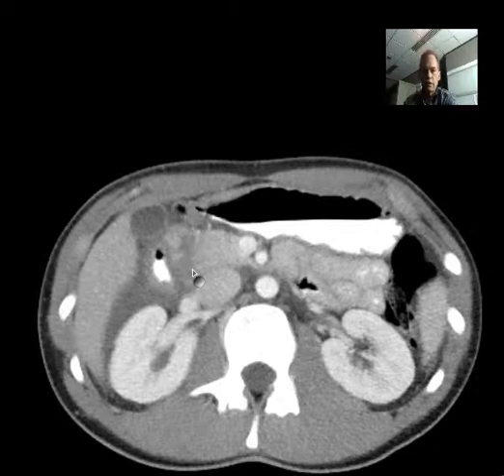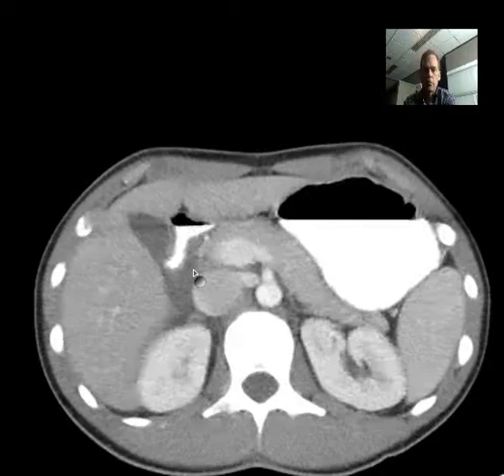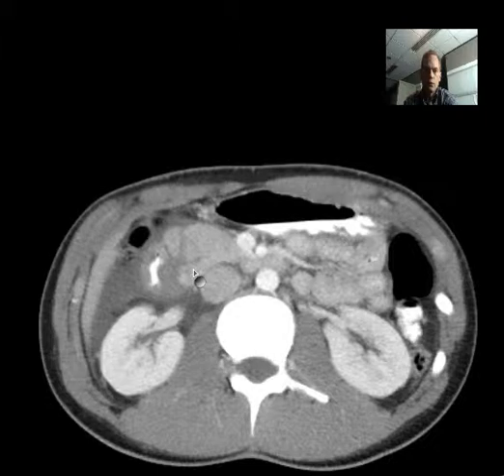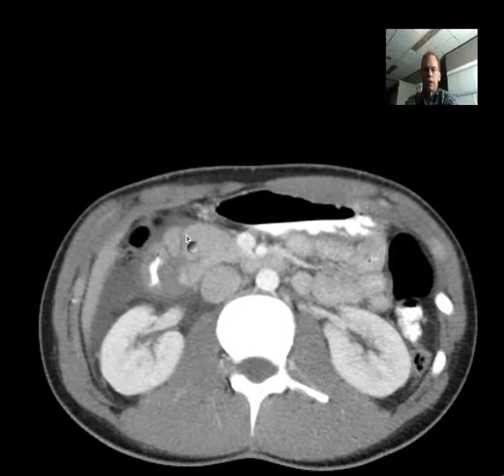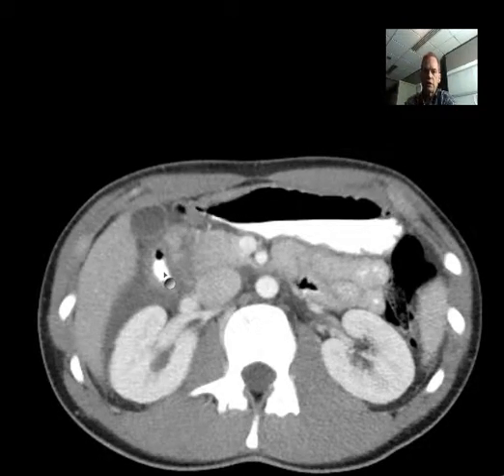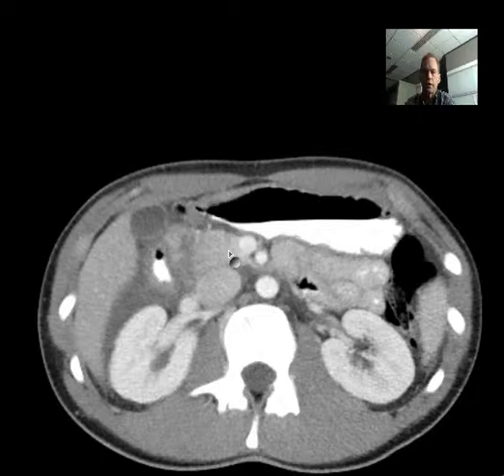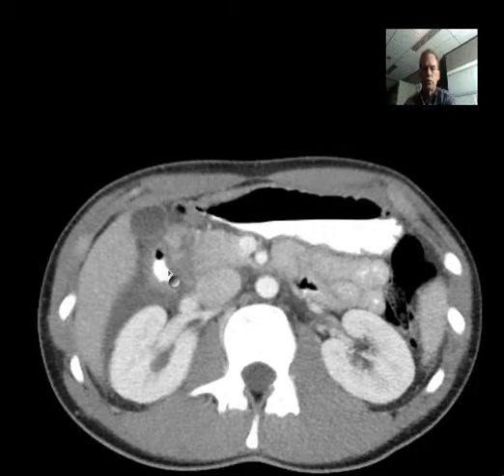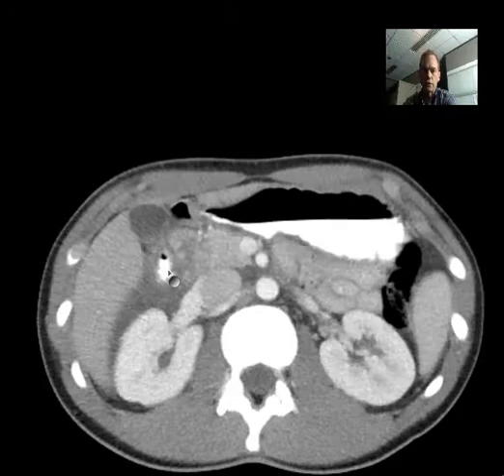As we go from top to bottom, we can see this cleavage plane within the pancreatic head. The part of the pancreatic head that abuts the duodenum is basically separated from the remainder of the pancreas. It's therefore very likely that the common bile duct, which courses through the pancreatic head and then enters the second portion of the duodenum, has been injured as well.